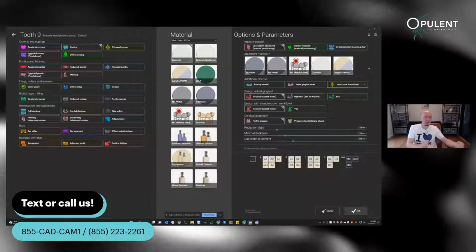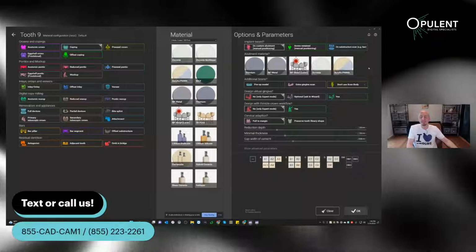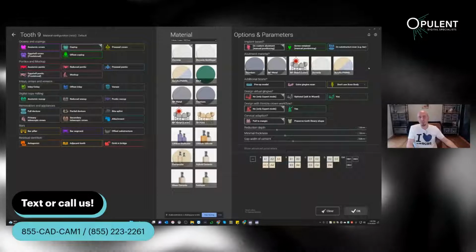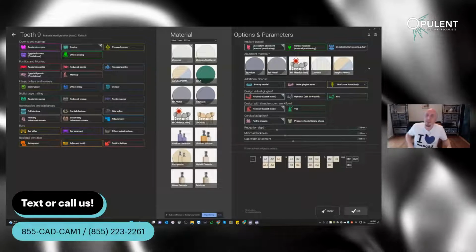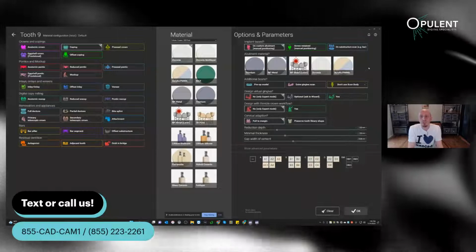And you're looking at things, trying to figure out how did you miss that? Stuff happens like that. Maybe your window is now too short to return the part. You can do that later, but to order another part and get that all taken care of that way, your quicker solution is to change your design really quick.